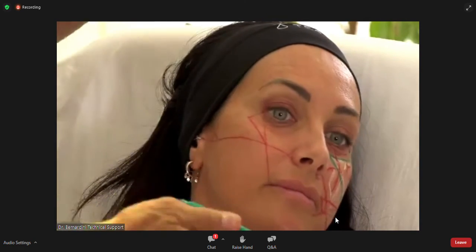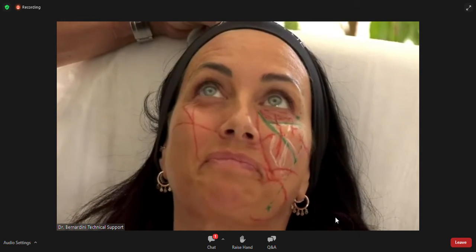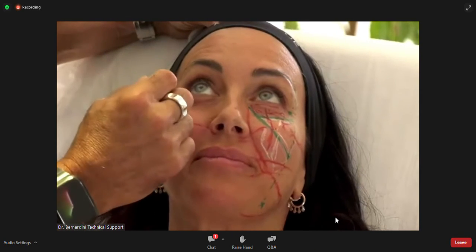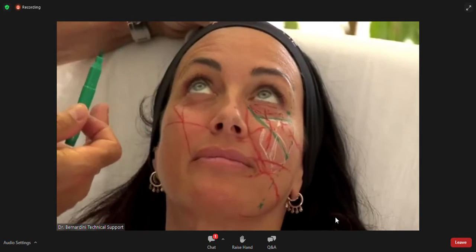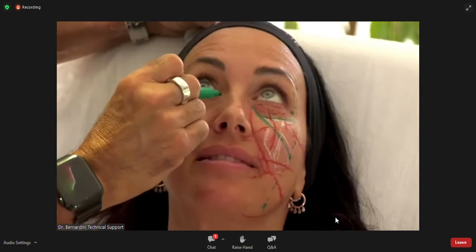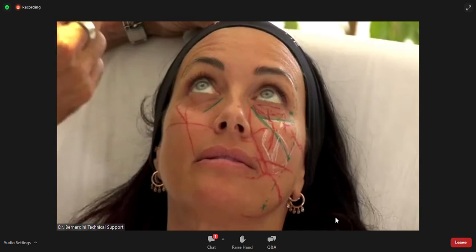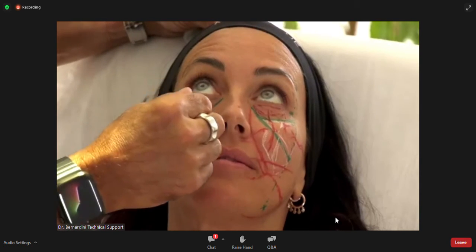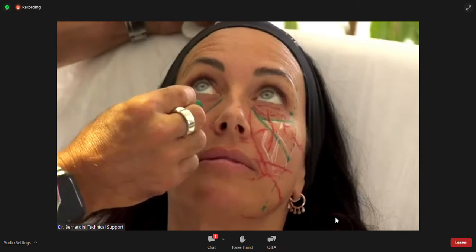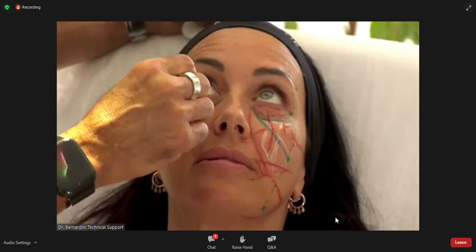Now, what else do I do? Mark. Serena, bravissima. The best patient. Look up for me. I mark the defect. The defect is a V deformity, so the medial arm of the defect, the lateral arm of the defect. They meet at the apex of the V deformity, and I mark this point.